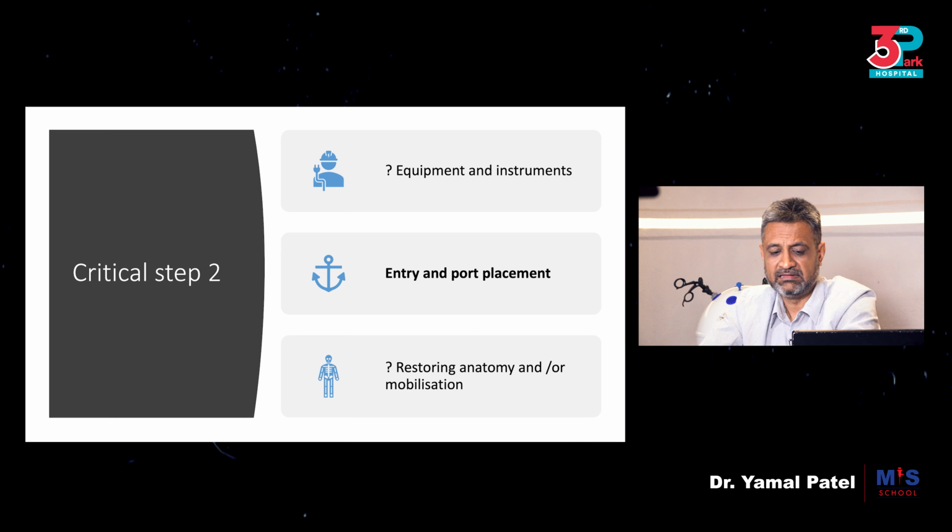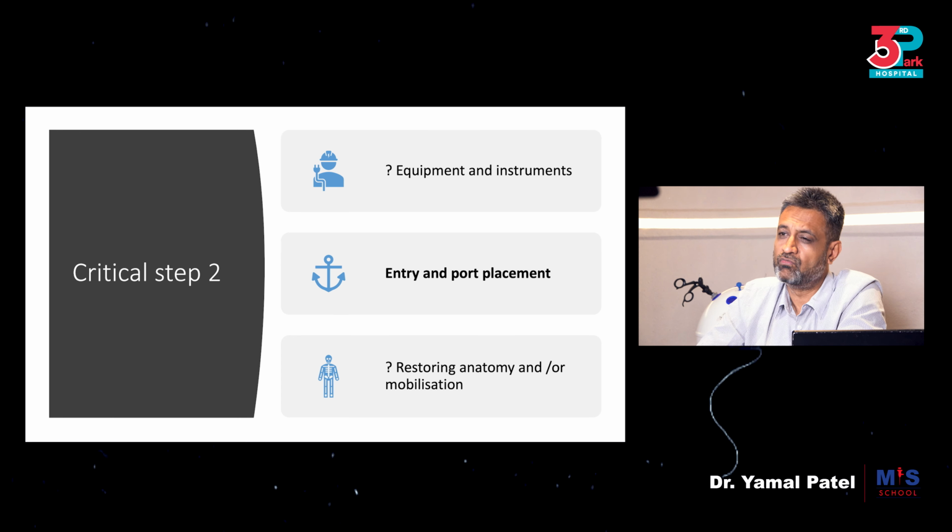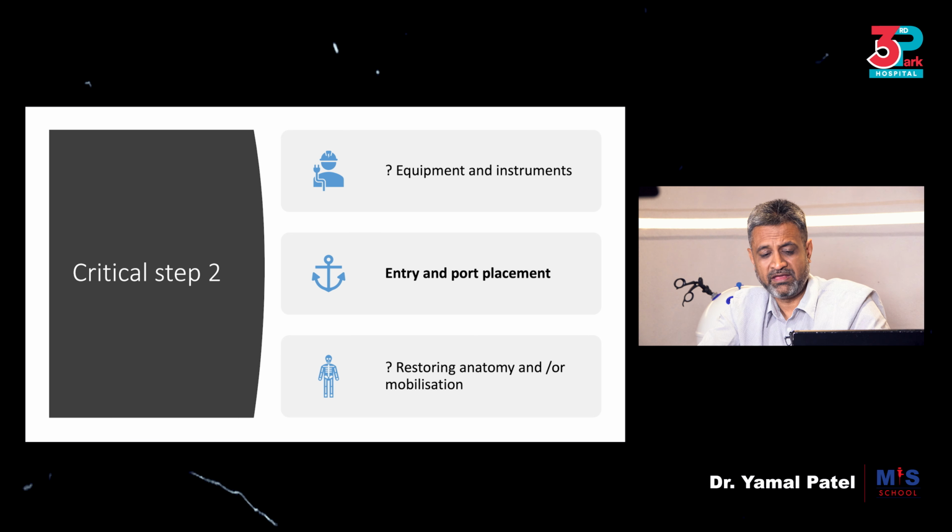Once you've done that, obviously the next step in the procedure would be about restoring the anatomy and exposure. So you have to have a good exposure if you want to continue with doing the procedure in a simplified and straightforward way. If you don't have good exposure, then there will be a problem about the time taken and the risks that you're likely to expose this patient to.